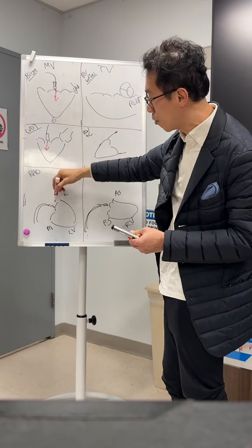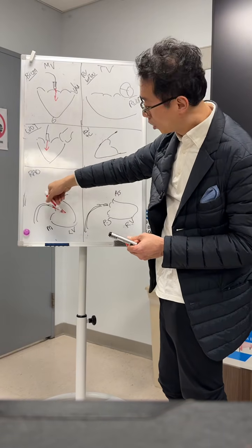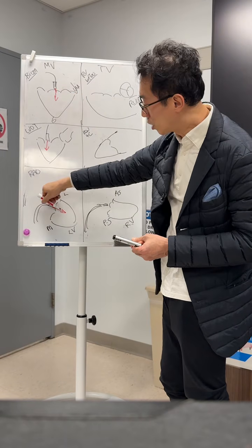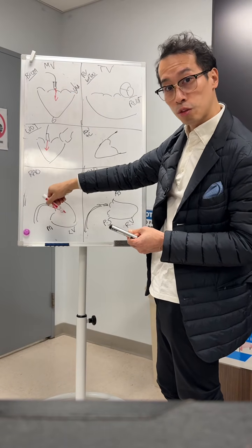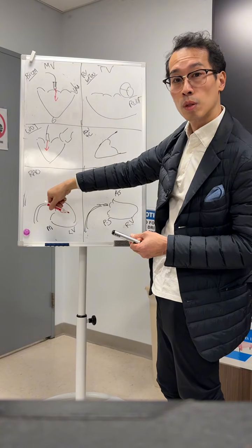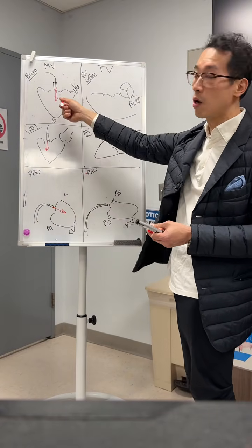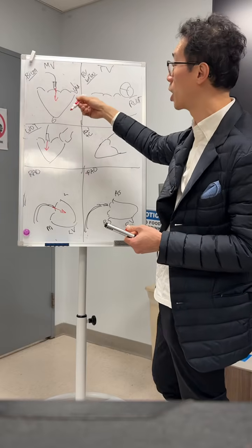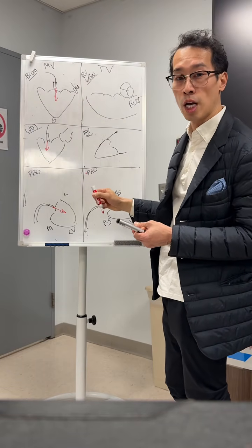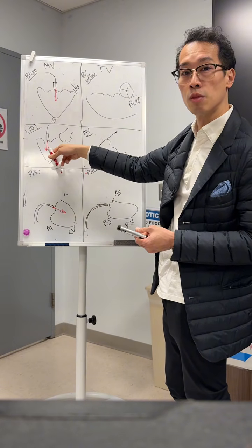And this is the same thing as I mentioned before. You want to go straight. This is lateral dive, this is medial dive, and you can correct it based on this. If you see yourself going medial dive on fluoro, even though echo is not showing you, you should be able to correct it yourself, because fluoro is much higher resolution. Sometimes you have artifact, you have some other imaging issues that will compromise your image going in. You should be able to use fluoro to see that. The only thing you cannot see in fluoro is anterior-posterior, and that you need to rely on this view.